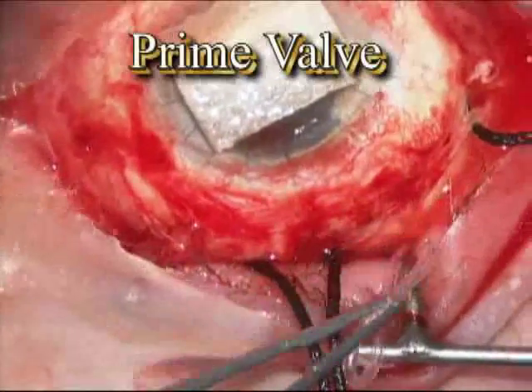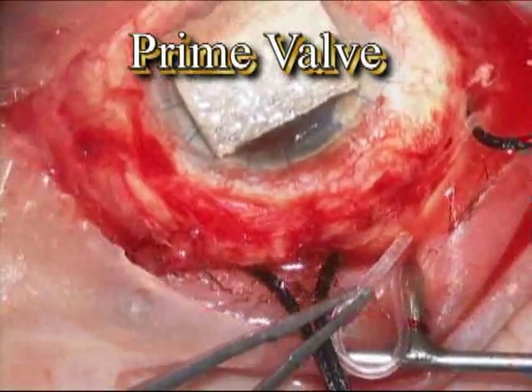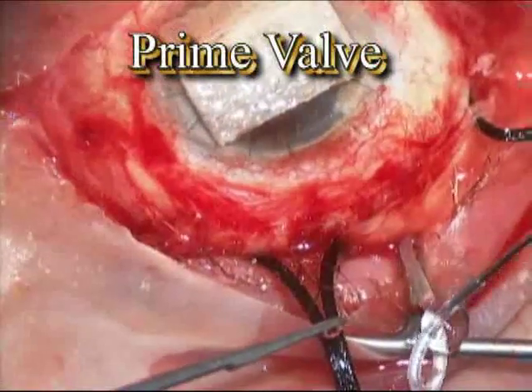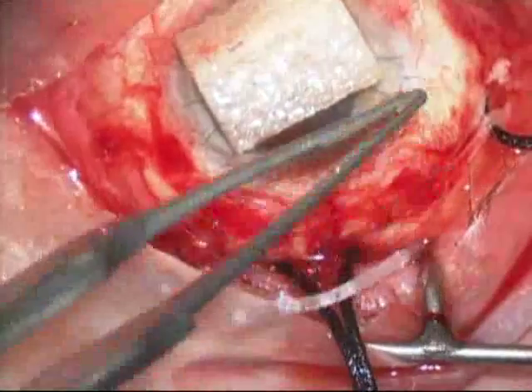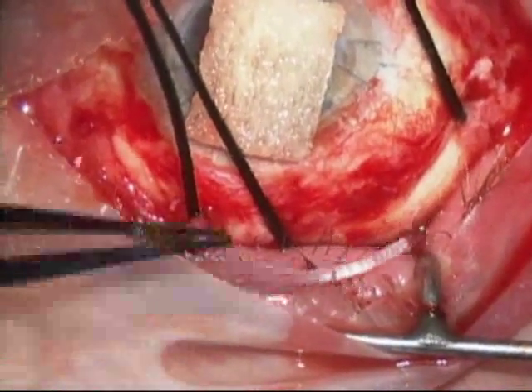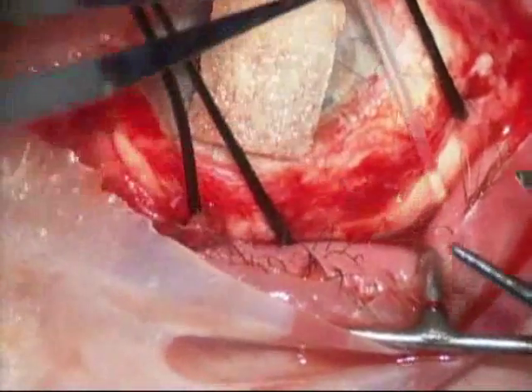Once the plate of the AMED valve is secured to the eye, the valve is primed. The AMED valves have a flow control within them, and it's important to flush some saline through the valve to open that little flow control before inserting the tube into the globe.